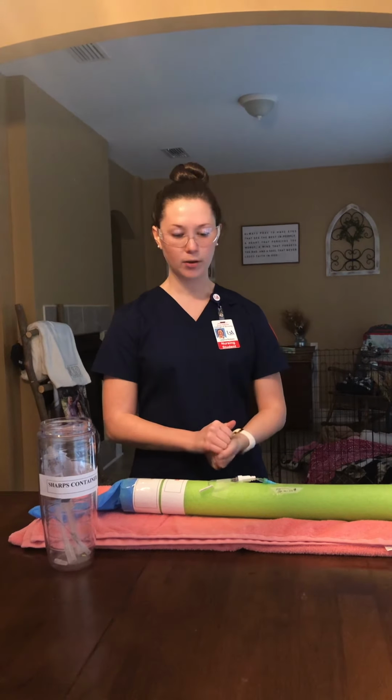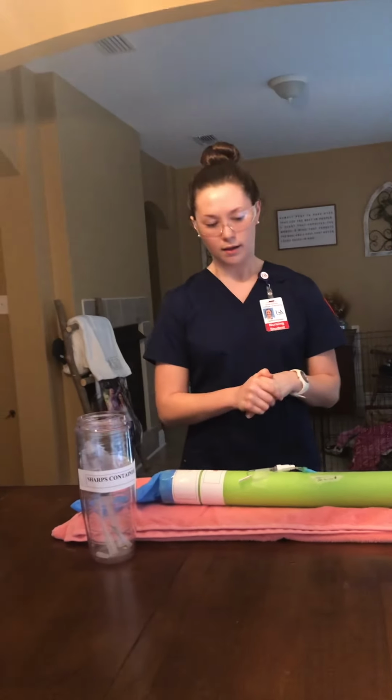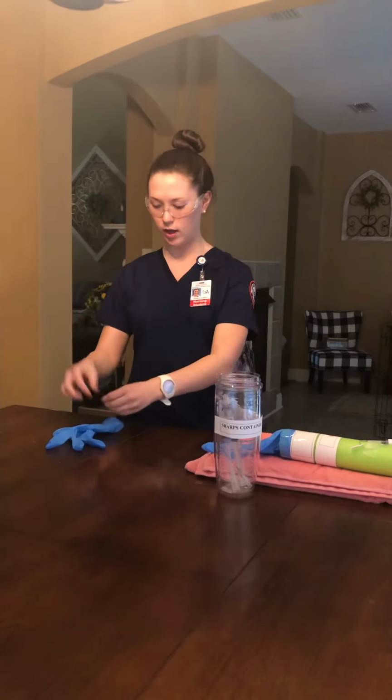So the next thing I'm going to do is discontinue the catheter. So what I would want to do is make sure I had gloves on. I would want to put on gloves.